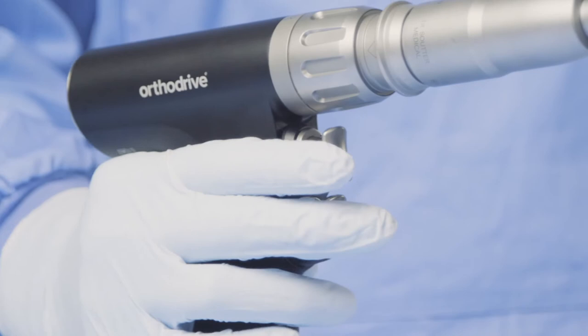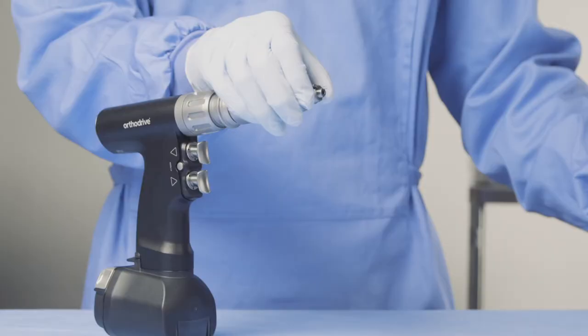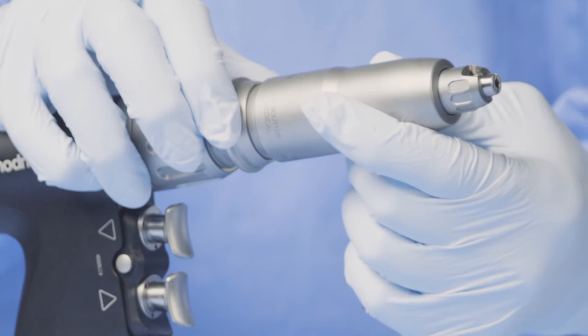Once done with the saw, place the tool back into safe mode and twist the collar on the nose to release the blade. Slide the blade straight out. To then release the attachment, pull back on the collar on the MBQ, turn 45 degrees anti-clockwise, and slide out.